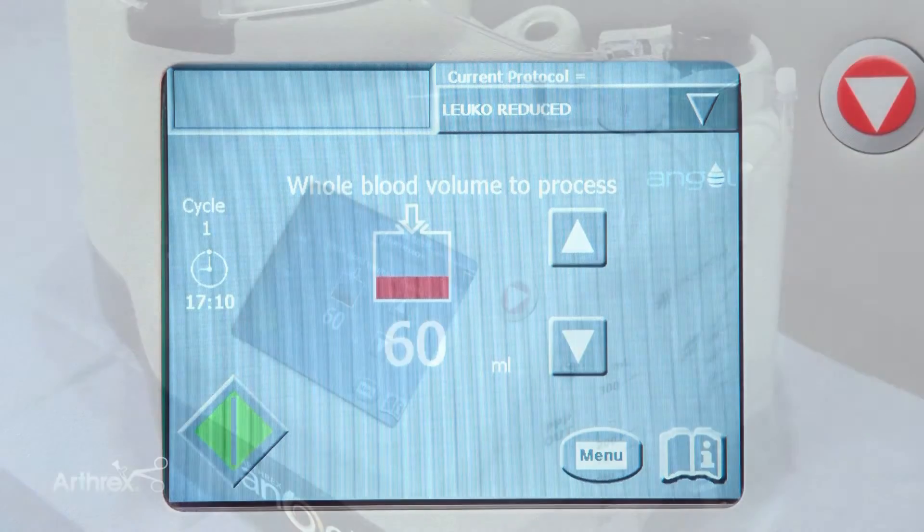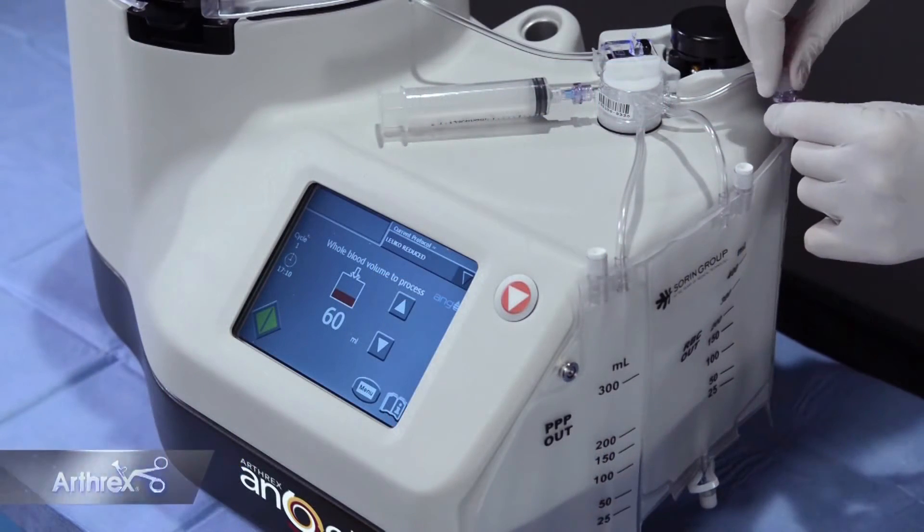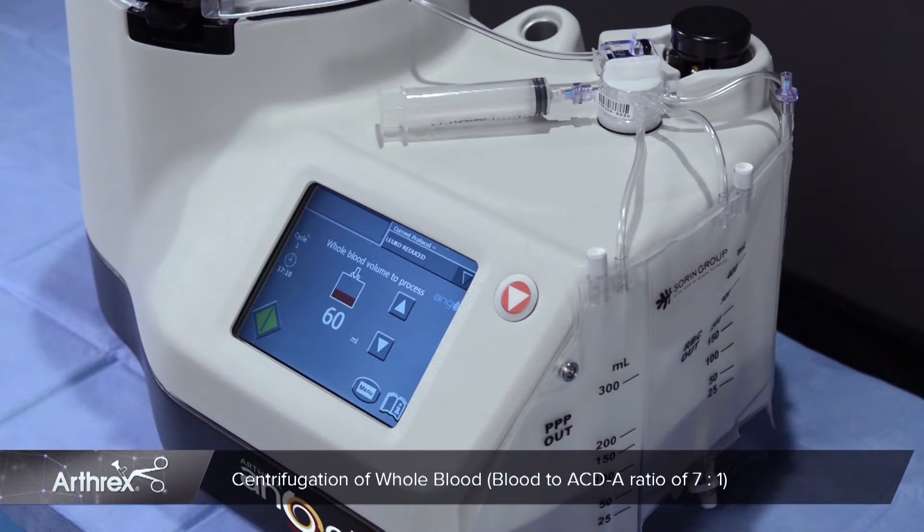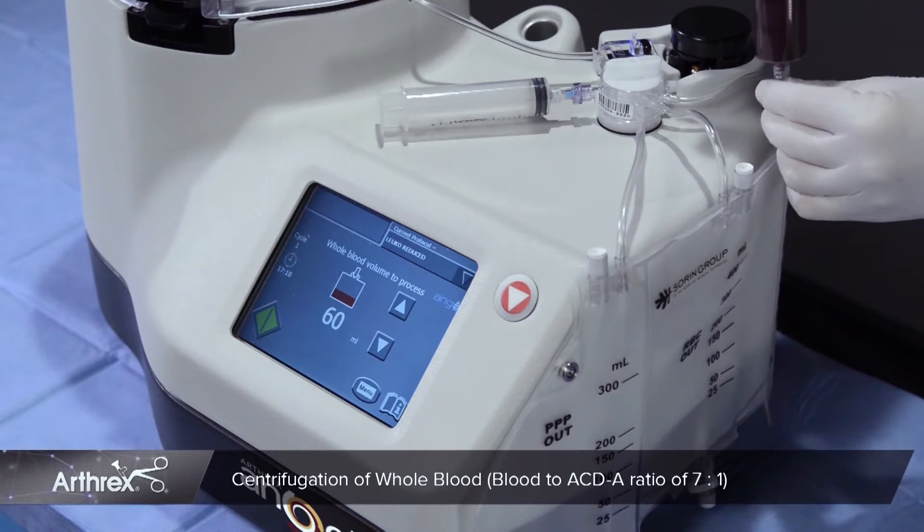Press disposable set is loaded to advance to the next screen. Centrifugation of whole blood requires ACDA at a ratio of seven to one.